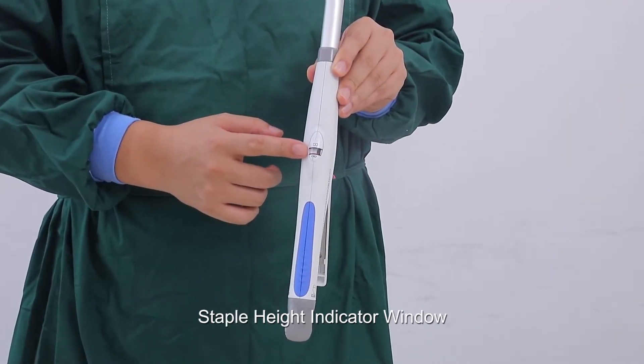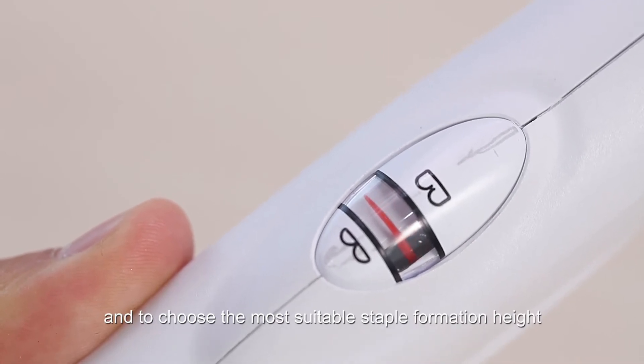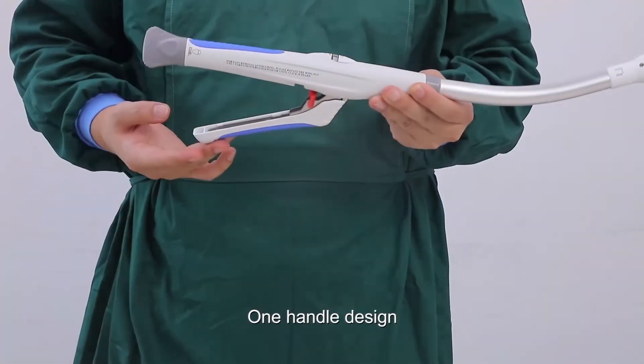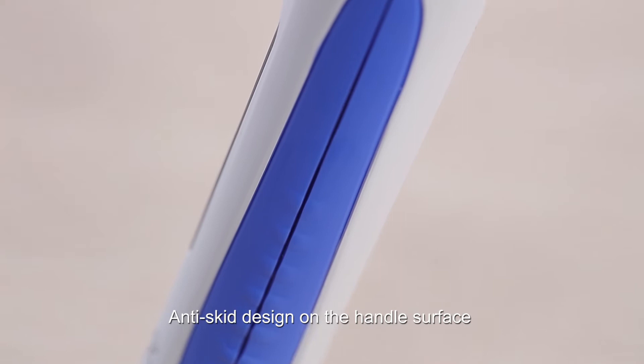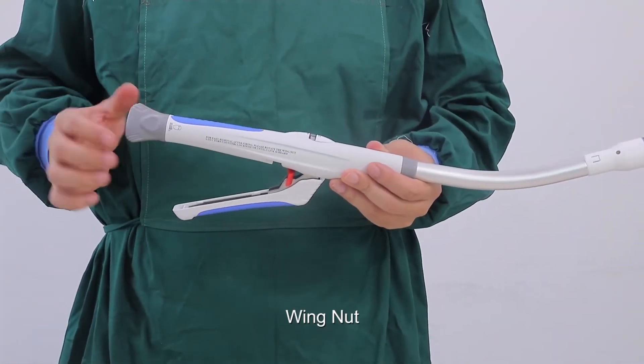The staple height indicator window is used to indicate whether it is safe to fire and to choose the most suitable staple formation height. The device features a one-handle design with an anti-skid surface, a red safety lock, and a wing nut.